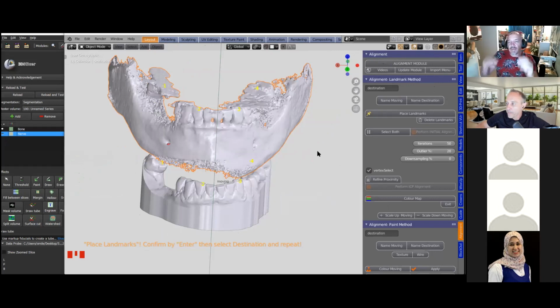Yes, Wolfgang, because if you think of a plane, like just a sheet of paper, and you put 4 points, and you have another sheet of flat paper, and you put 4 or 5 points, what can happen is that these will align with each other, but one of them will flip over like that. Yeah, I've seen that happen. So you want to try and lock them in somehow if you can on the X, Y, and Z axis.